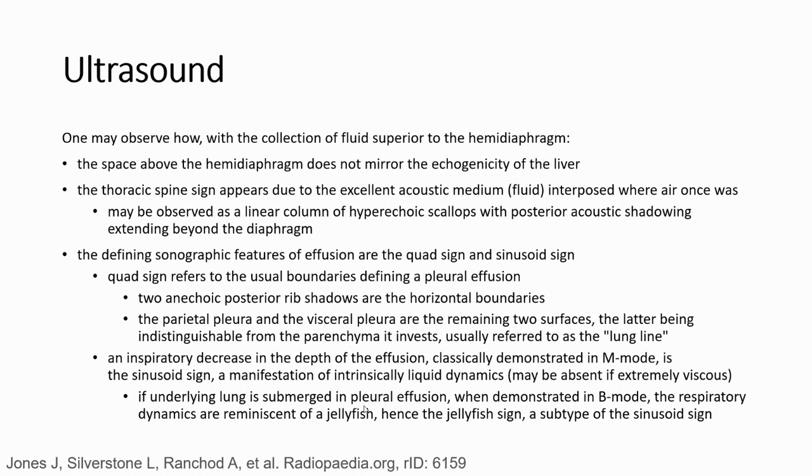An inspiratory decrease in the depth of the effusion, classically demonstrated in M mode, is the sinusoid sign, a manifestation of the intrinsically liquid dynamic. If underlying lung is submerged in pleural effusion, when demonstrated in B mode, the respiratory dynamics are reminiscent of a jellyfish, the jellyfish sign, a subtype of the sinusoid sign.